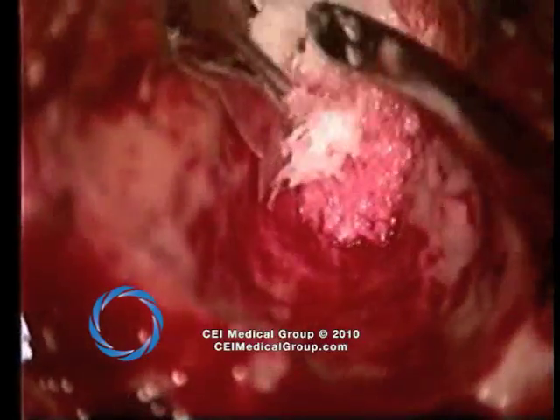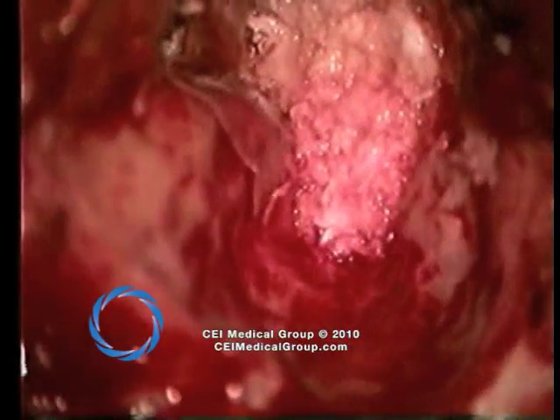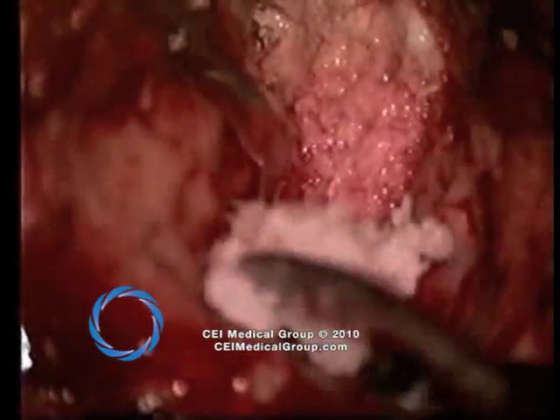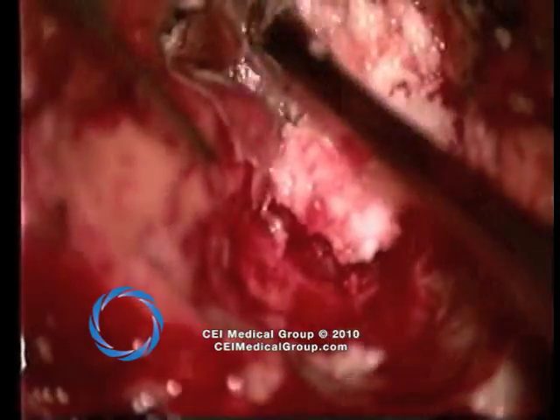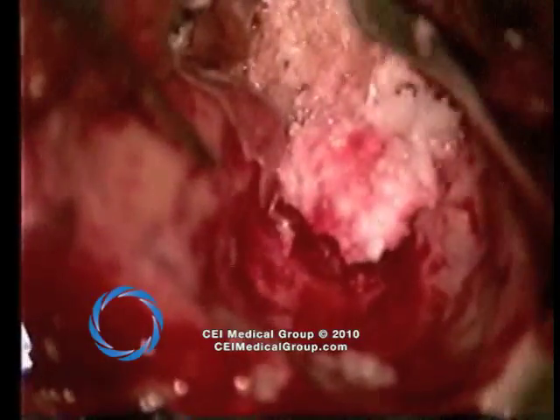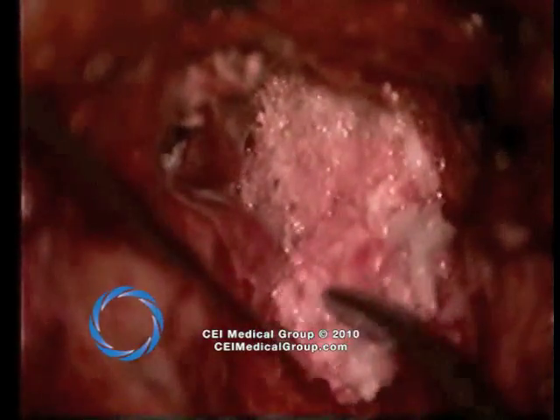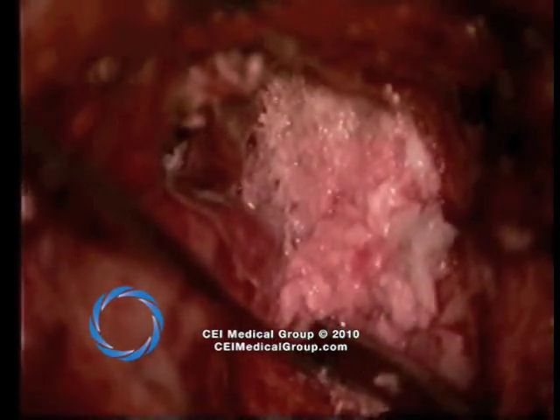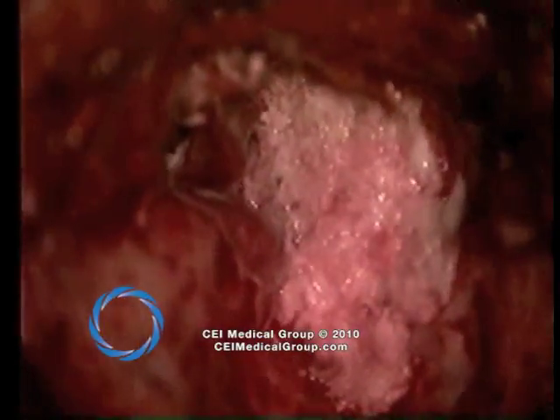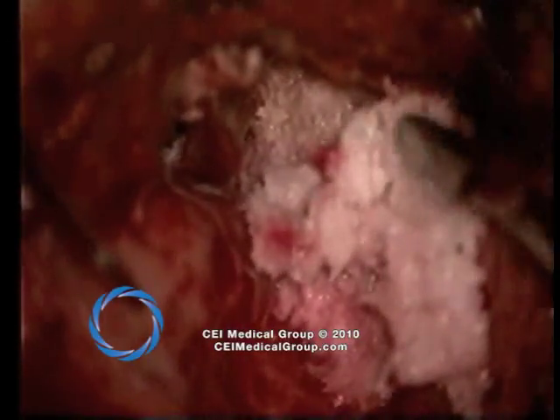In a similar way, the fistula of any semicircular canal can be reconstructed. The fascia is placed between the fistula and the bone pate. Sufficient moisture is necessary within the bone chips in order to allow appropriate handling. The bone need not be compressed severely and removal of a portion of the water content is occasionally needed. The chips seen in this instance were taken with a 6mm burr; the pate utilized should be of this size or smaller.